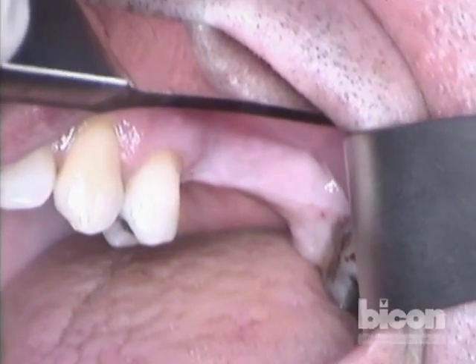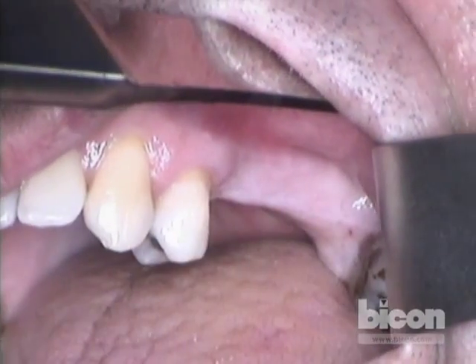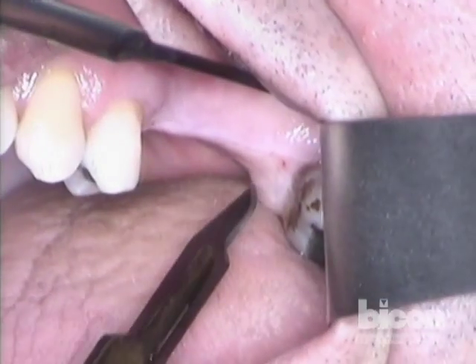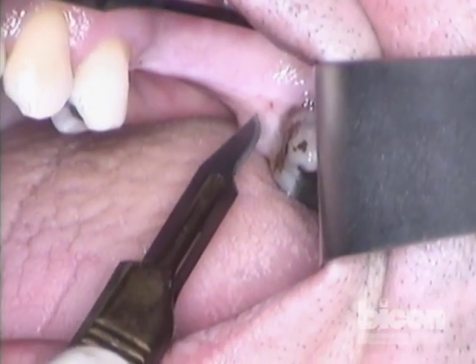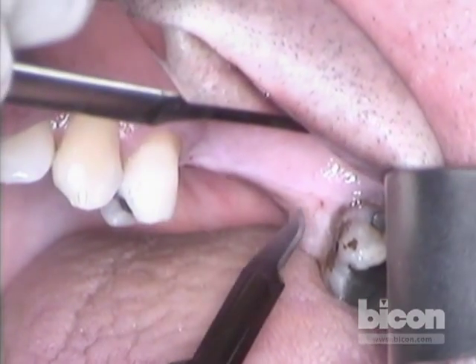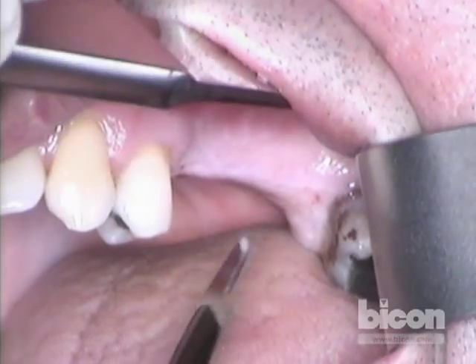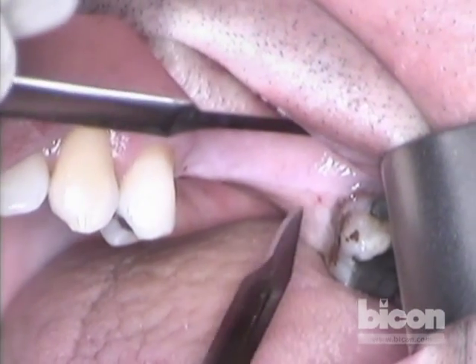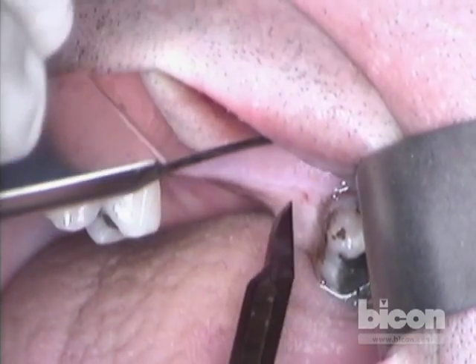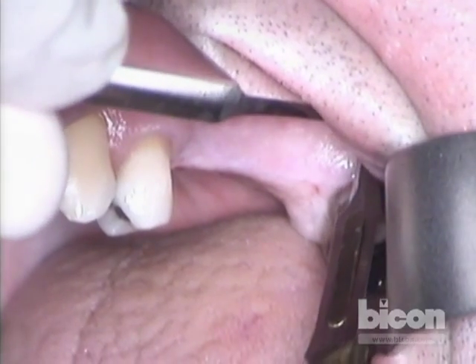The recent extraction of the second bicuspid has left a slight area of weakness at the top of the crest. The other extractions, although missing for quite some time, have left a kind of an imprint — a little divot right at the crest. So we cannot go beyond them by more than a millimeter or two, but we have to lap a little bit over the crest to have access, visibility, and to be able to close the crest over these implants.